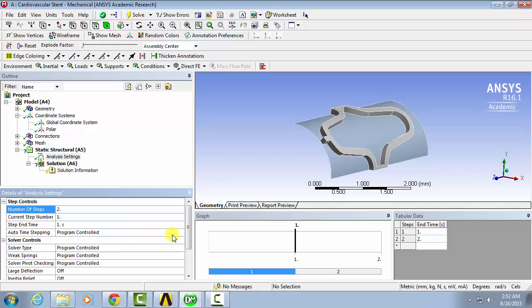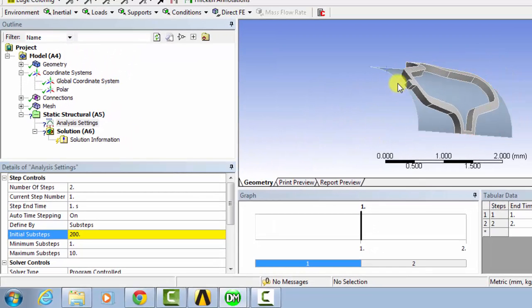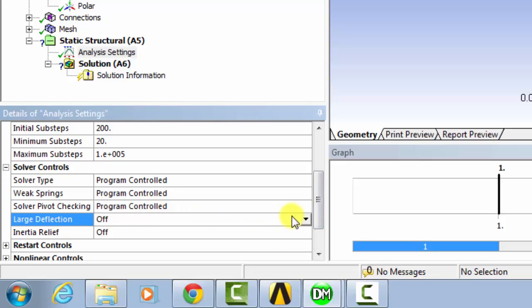From here, we'll change the auto time stepping controls to on. That way we can define the amount of substeps that we can break the problem down into. So we'll go with initial substeps, it'll be 200. And this will be to make sure that the balloon doesn't go straight through the stent on the first time step. The minimum time steps, we'll make 20. And then we'll make the maximum number of time steps 1 times 10 to the 5. And then lastly, we'll just turn large deflection on.